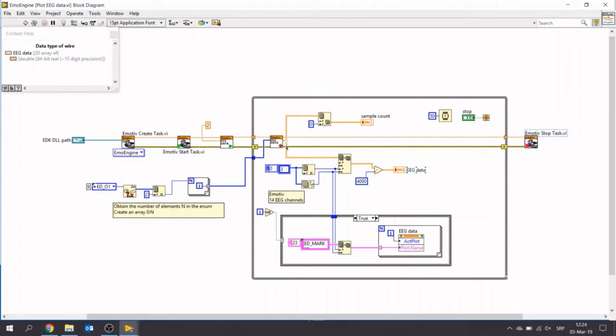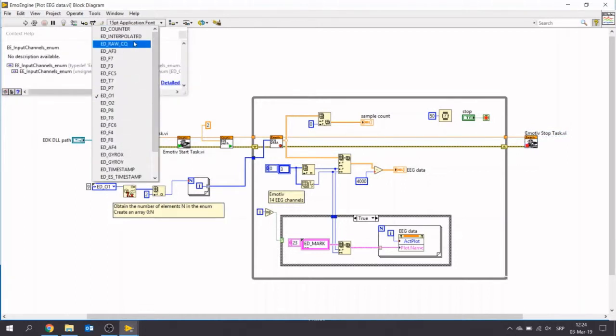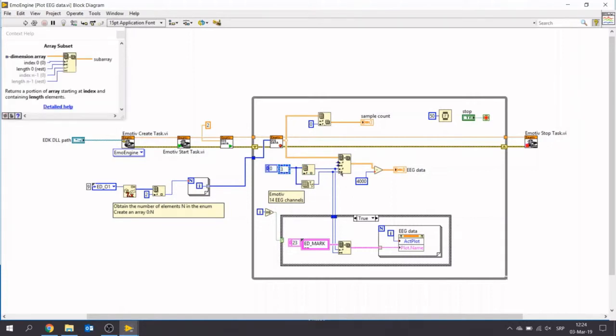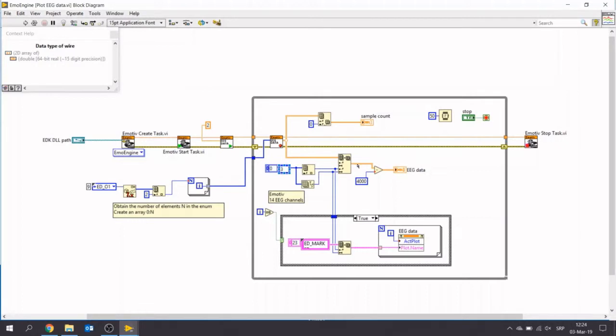After we get these 14 rows, or I think even more, because we are not only gathering samples from the electrodes on our Emotiv, but also from these 3 things here. So we are going to eliminate those in that way that we are going to tell that we are going to use only third element as our starting point for our array subset, and we are going to have 14 elements of length. So here we have these 14 elements that correspond to 14 electrodes on our Emotiv device.